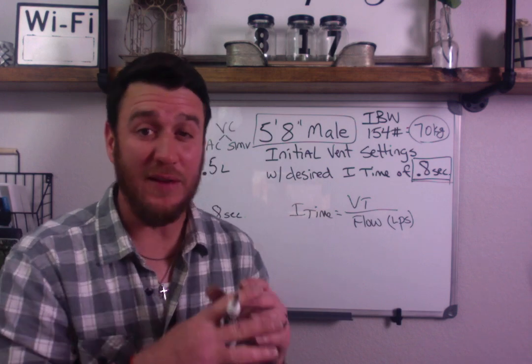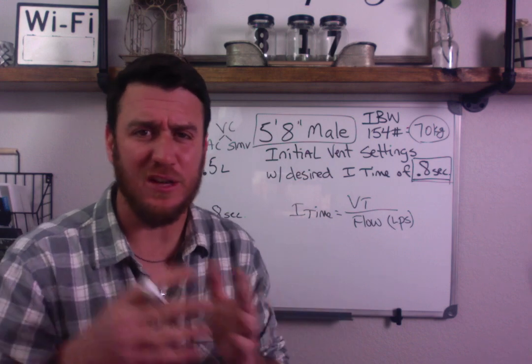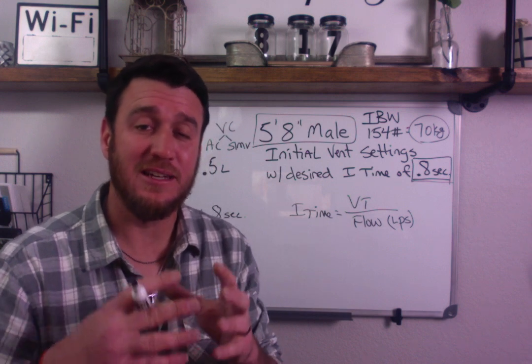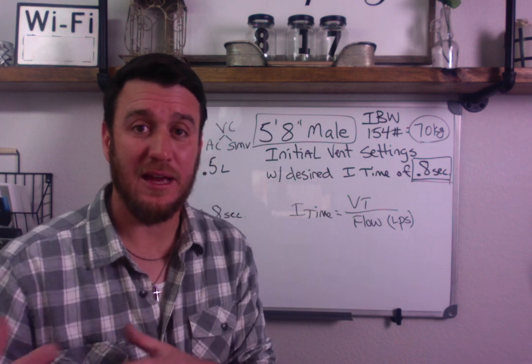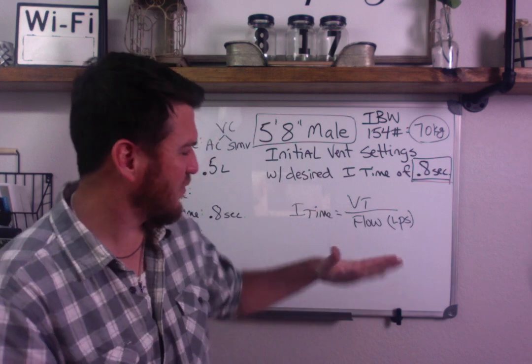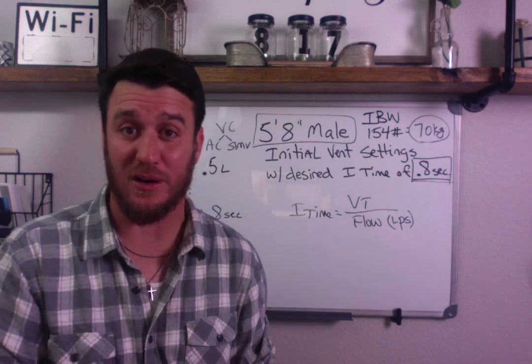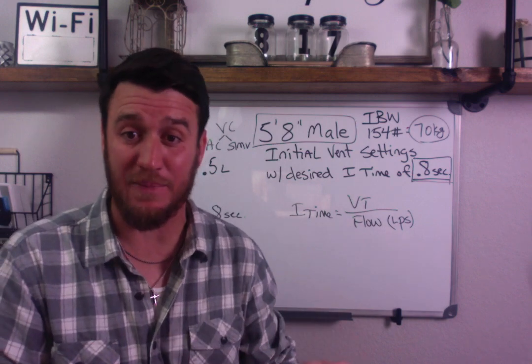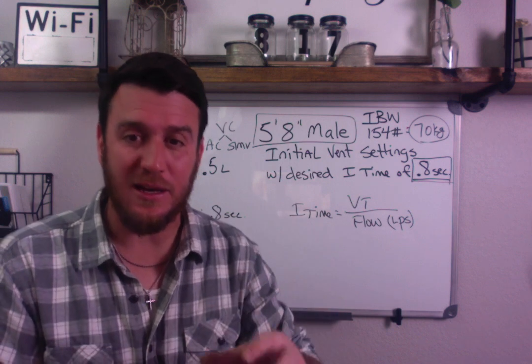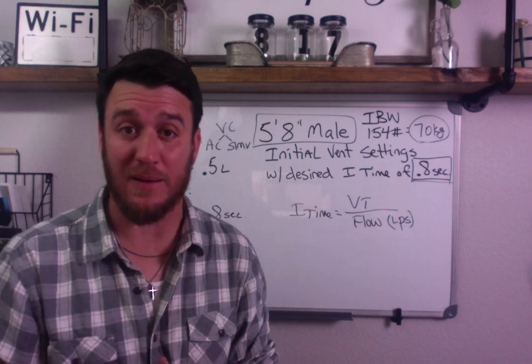Think about it. If you have somebody on 60 liters per minute, a tidal volume doesn't last minutes. A tidal volume lasts seconds. And so when you think about it like that, it makes sense that we turn flow into liters per second. And this is really what the ventilator operates off of. It operates in liters per second, not liters per minute, even though we set a liters per minute. Okay, I know that's kind of confusing, but you just have to wrap your brain around it and make it make sense.